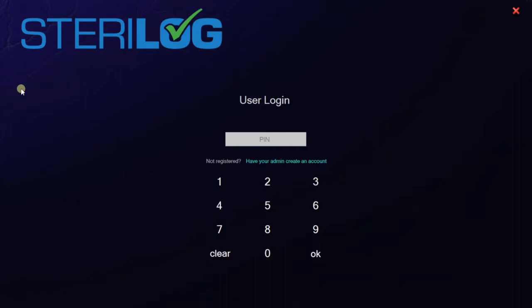When you first get your system, you'll want to start by setting up some users. You begin by logging in as the admin with the default 000 PIN.